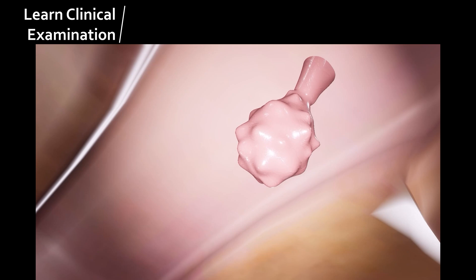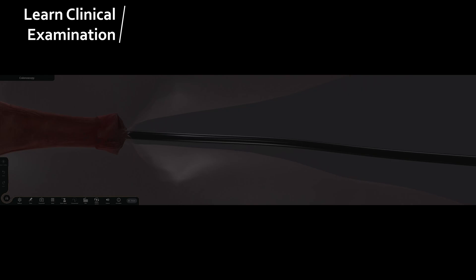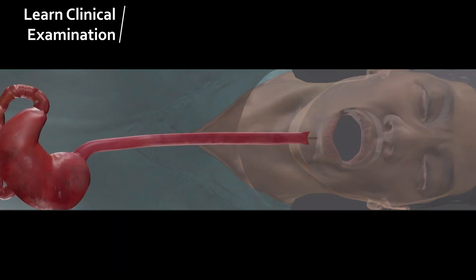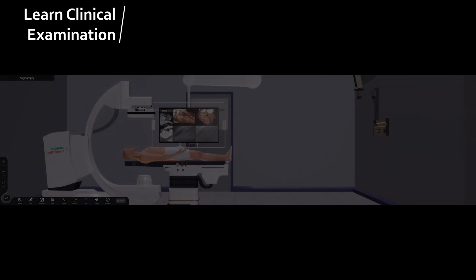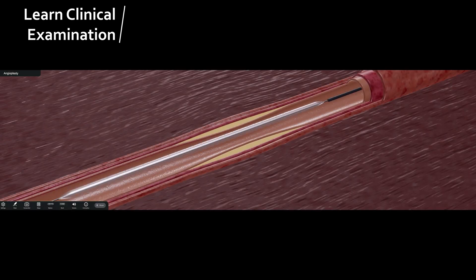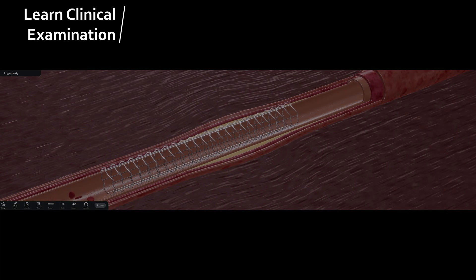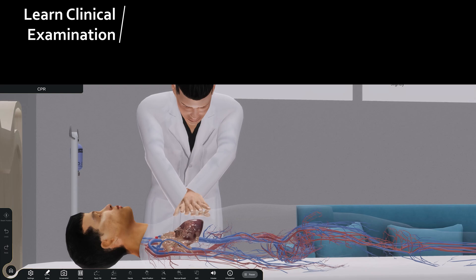Clinical examination. Learn about various diagnostic and therapeutic procedures used every day in hospitals, like colonoscopy, endoscopy, bronchoscopy, angiography, angioplasty, and CPR, with the help of life-like simulations.